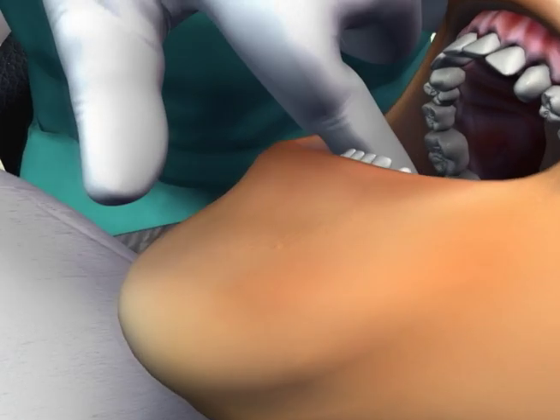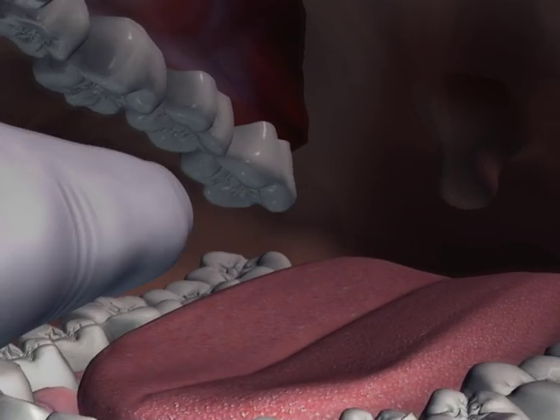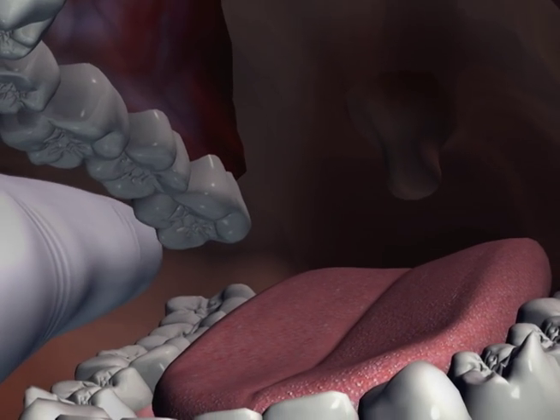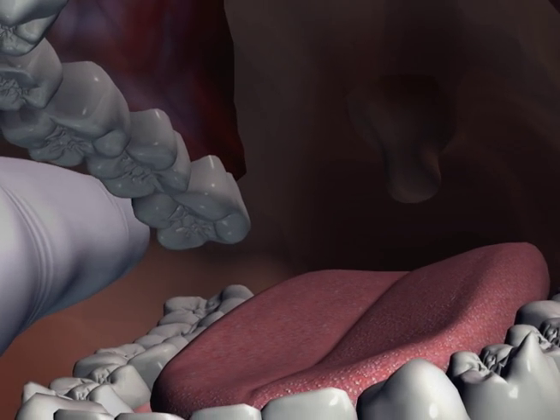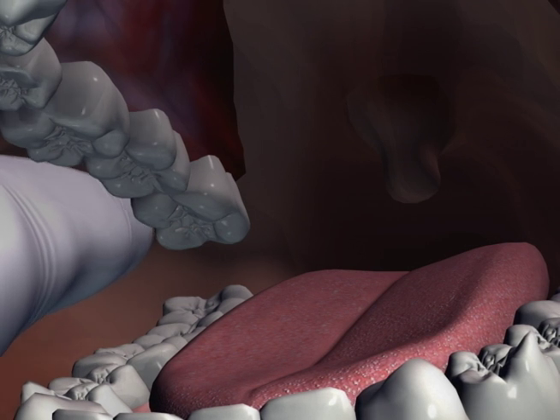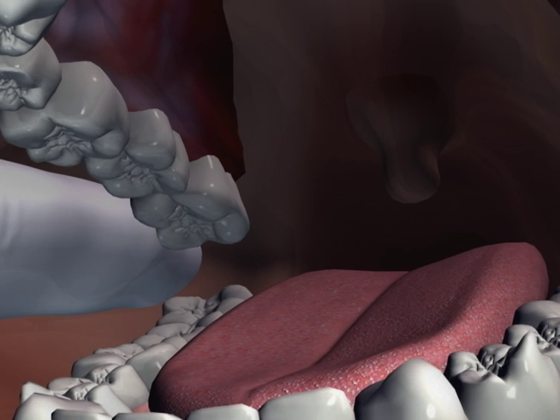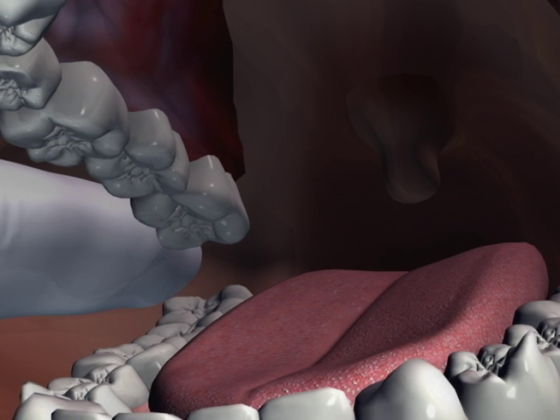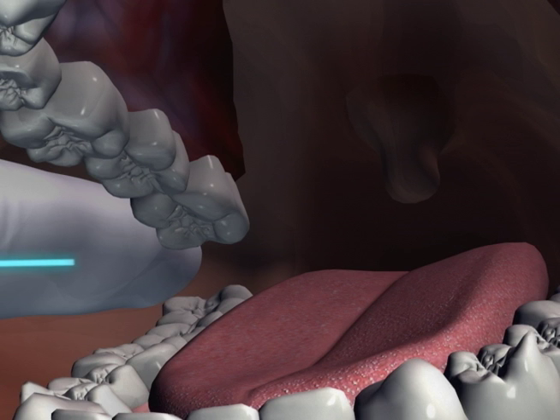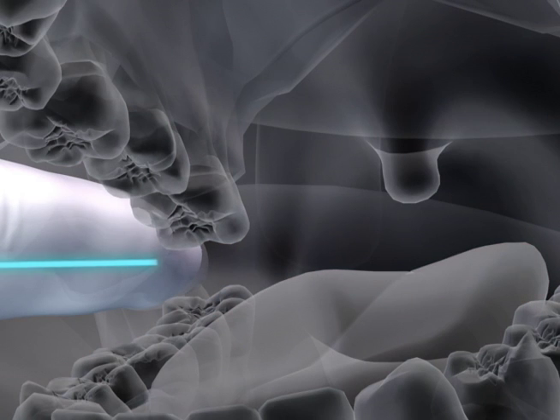The operator's finger palpates the greatest depth of the coronoid notch and moves the finger laterally to make the tissue taut. The finger is held parallel to the mandibular occlusal plane so that the middle of the finger coincides with the deepest part of the coronoid notch.